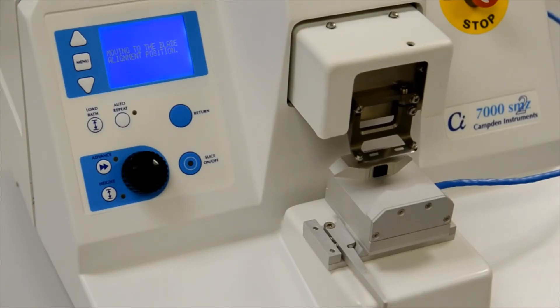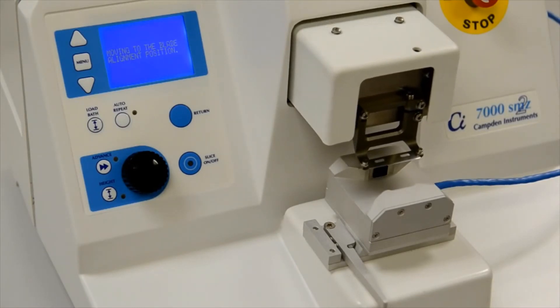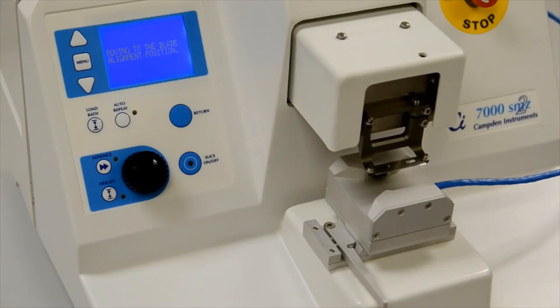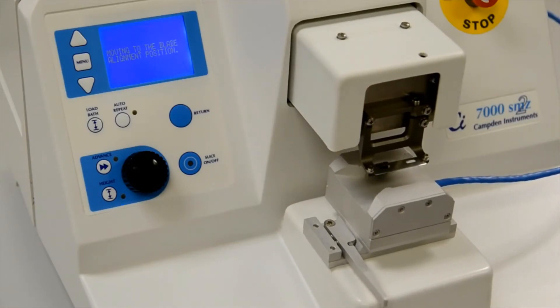The instrument will now reposition the blade edge relative to the Opti-Cal unit and ask you to press the Slice On-Off key to initiate blade vibration.